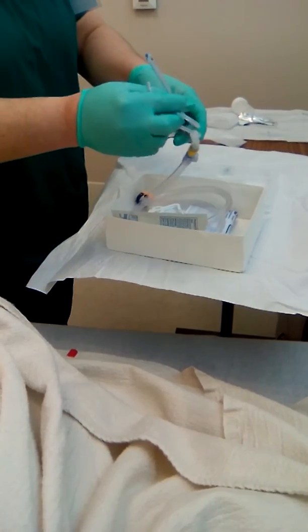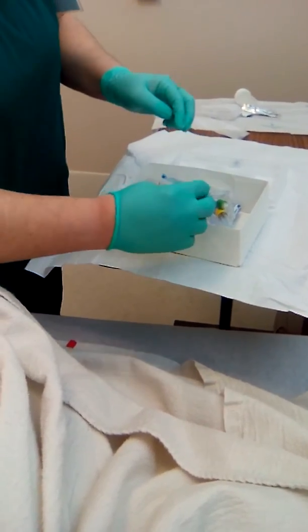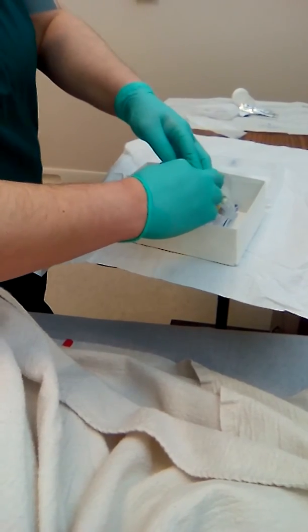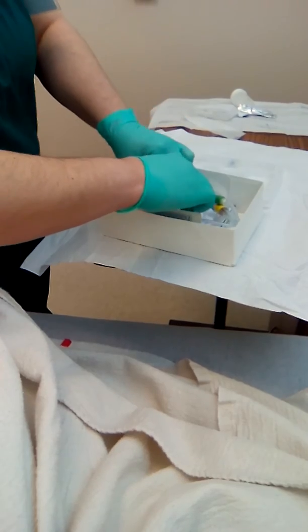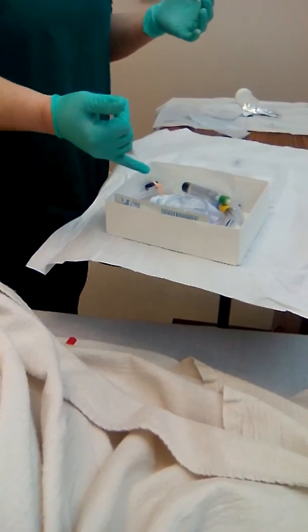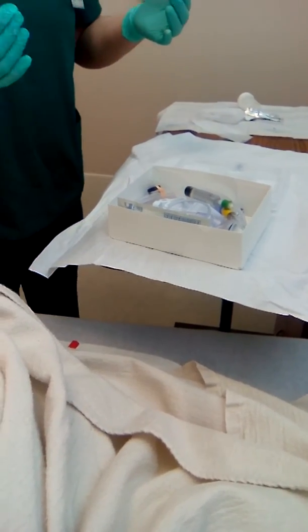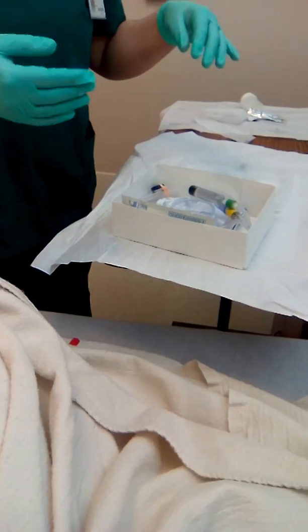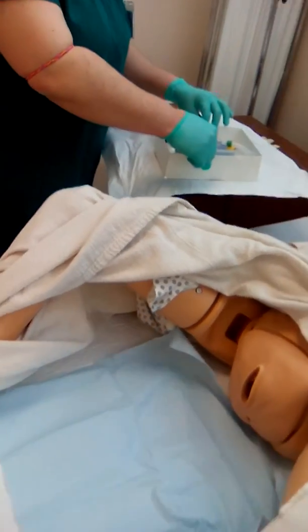Then I am going to place the catheter back inside the box. I will also ensure that my port is closed on the drainage tube. I will then move my sterile field to between the patient's legs.